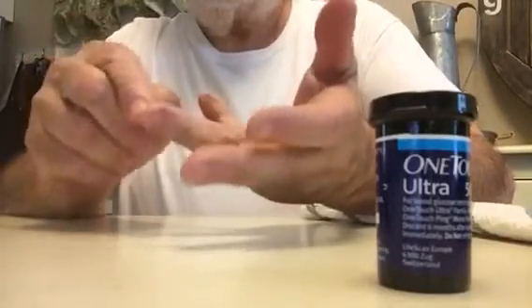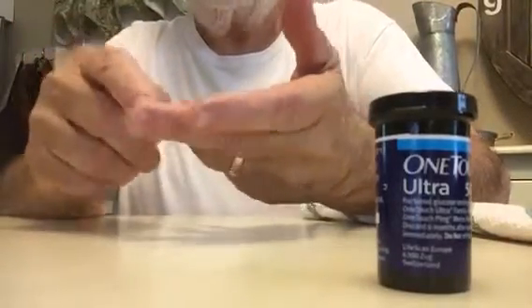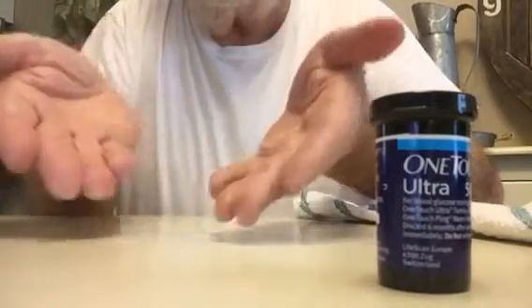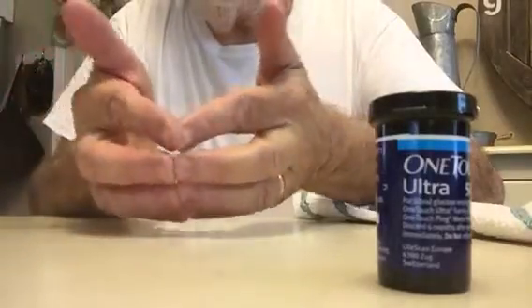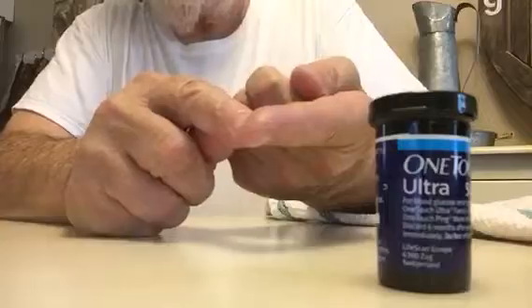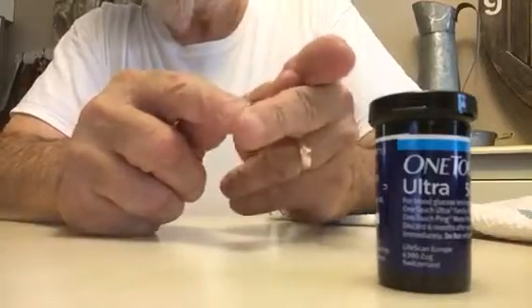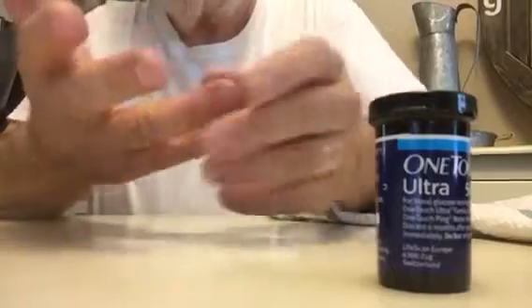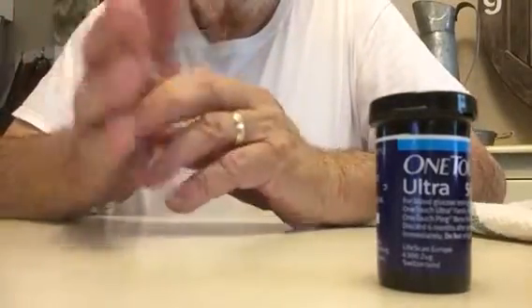A couple of quick tips: don't stick on the pads of your fingers — they're the most sensitive, and since you touch so many things with your fingertips they'll become very sore. I always test on the sides, and usually I just don't even feel the prick.